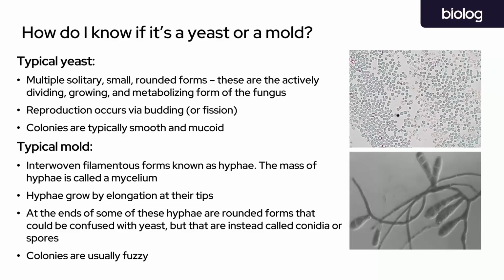So for many of those, we do have those included in both the FF and YT databases. And so if you think you might have one of those dimorphic fungi, it would be good to just check the website for the database, or to check on your software, you can access the database locally and see if your hypothesized sample identity is in both databases or if it's just in one.